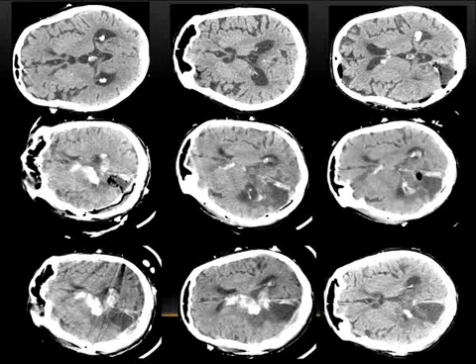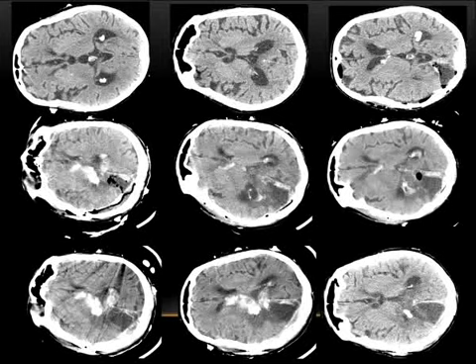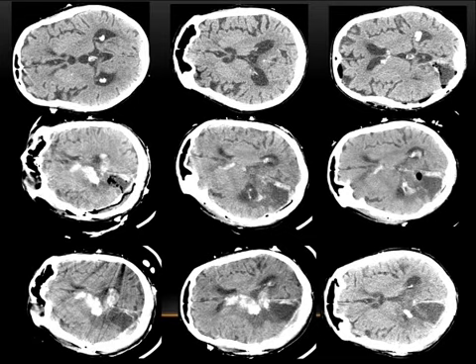So I went into our record, and here is a patient who came in, and these are not all the scans. There are probably 11 scans that were done in a period of about 3 weeks. This is not in temporal order, but there are a bunch of scans. There is a 100% difference in the dose here, from the lowest dose scan to the highest dose scan. There are 3 different vendor types represented in this data set.